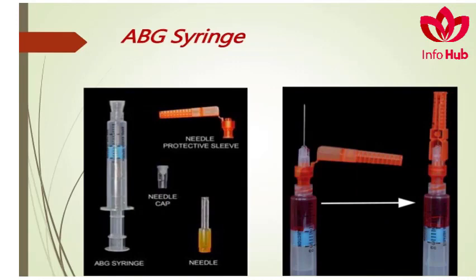And now you can see in this slide an ABG syringe. These are specialized arterial blood gas syringes with a disposable cap over them. You can see the blood in it is arterial blood.